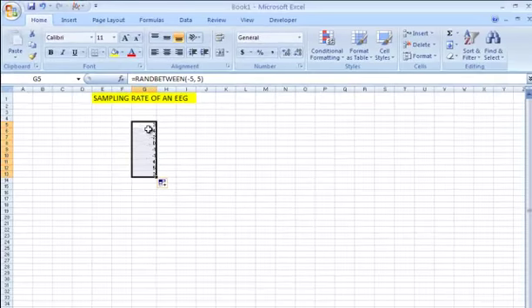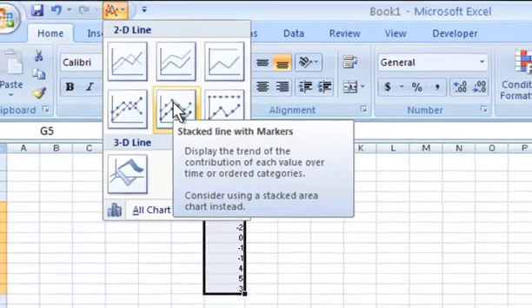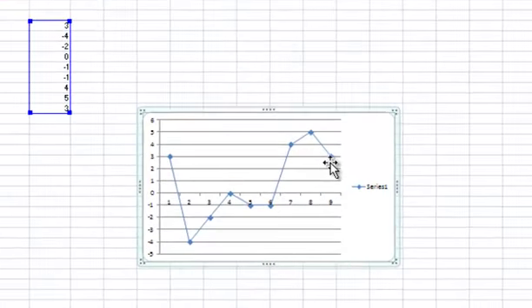If I plot it as a line graph, which I'm doing right here, I get these waveforms. So the waveforms that we see on the EEG are basically these data points that are connected together to form the line graph. Each of these data points represents a numerical value. So you can see that all of these are represented over here.